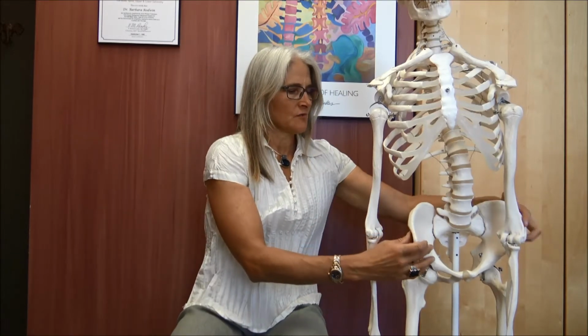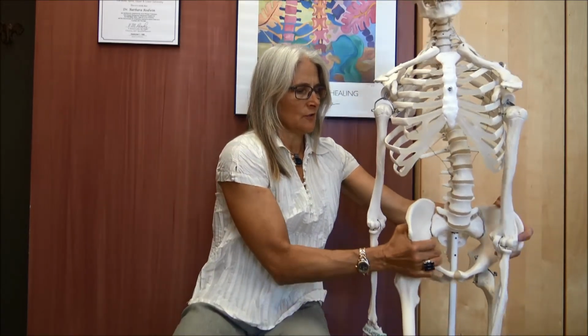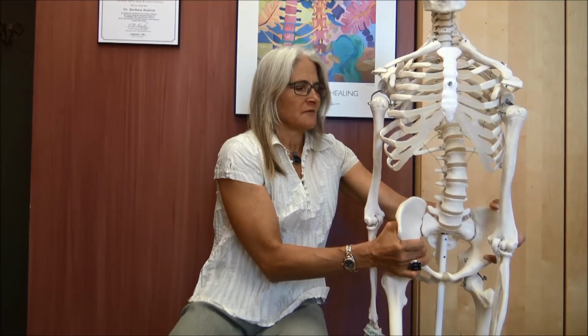And what I find with these lifts is we actually check with the patient. So if a patient is uneven and their hips are off like this much, we'll figure out which lift to put underneath them to help even them out. And patients can't believe the difference with this, because it makes their hips feel looser, their knees, their feet, and even their back, to be able to help with their treatment.